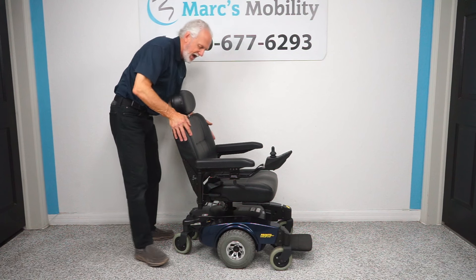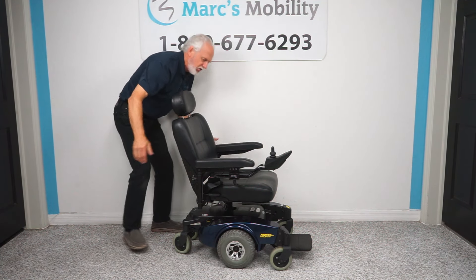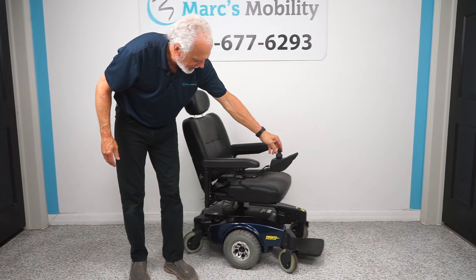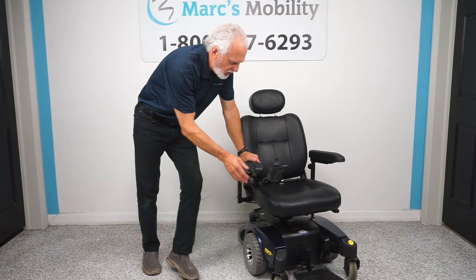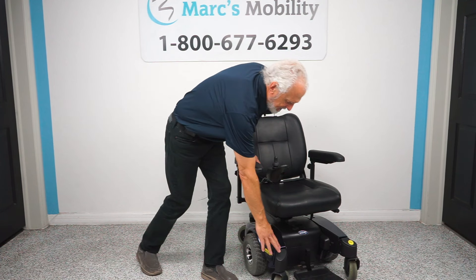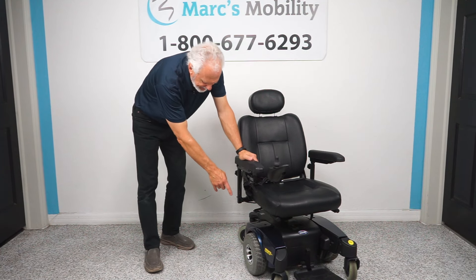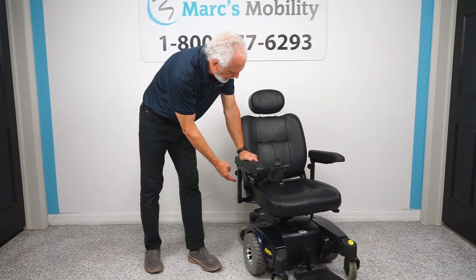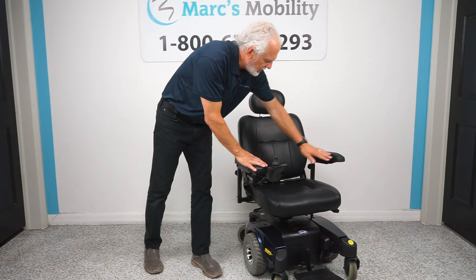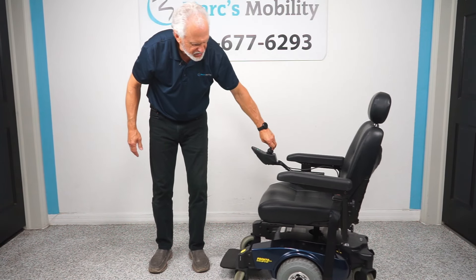We can get you to 24 inches since this arm can be moved in. So let's recap: we have a Pronto M51 power chair with a captain seat, suspension, recessed rear tires, solid tires, two motors, swivel seat, safety belt, adjustable back, adjustable headrests. The joystick can go on the left if you're left-handed. It's a really nice power chair and it's ready to go.